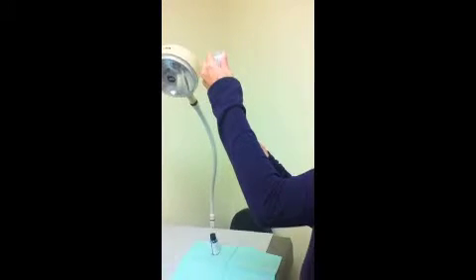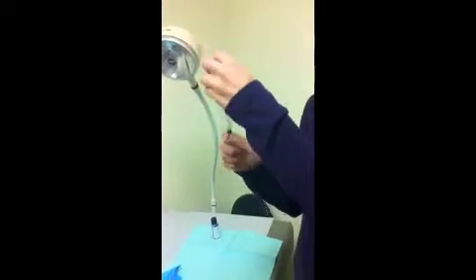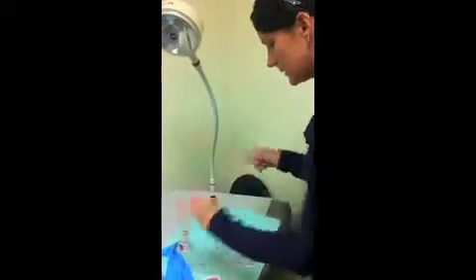And then we have 20 to 40 milligrams of methylprednisone acetate, which gives us a total of approximately 2 to 3 mLs that we will inject into the joint space. We will need to switch the needle out to a 27 gauge 1.5-inch needle for the actual injection. I'm going to go ahead and apply my gloves here.